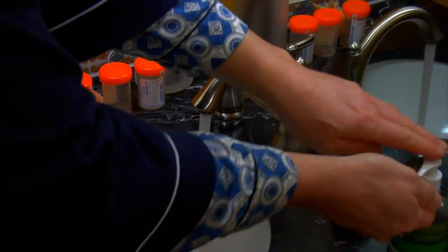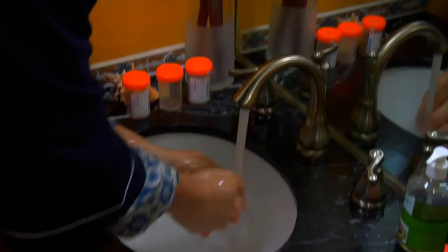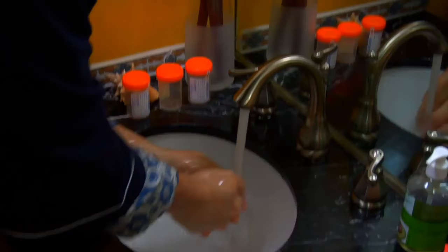Before starting, wash your hands with soap and water for 15 to 20 seconds. Rinse well and use a hand towel to pat dry.